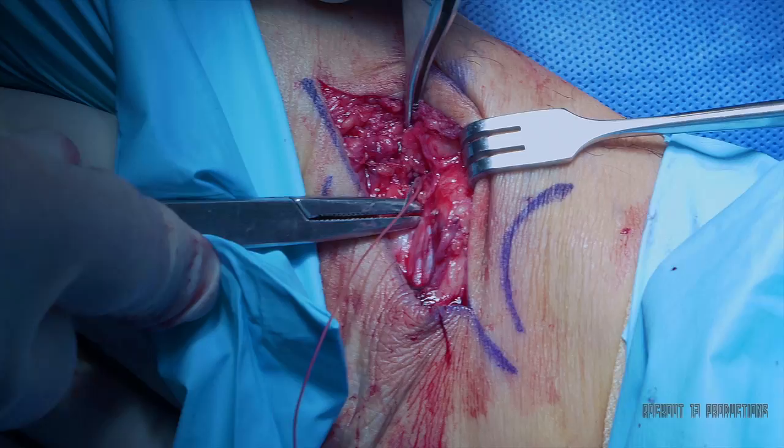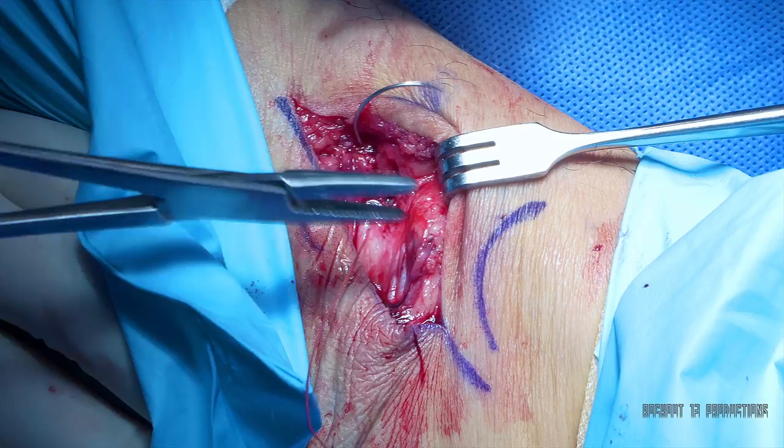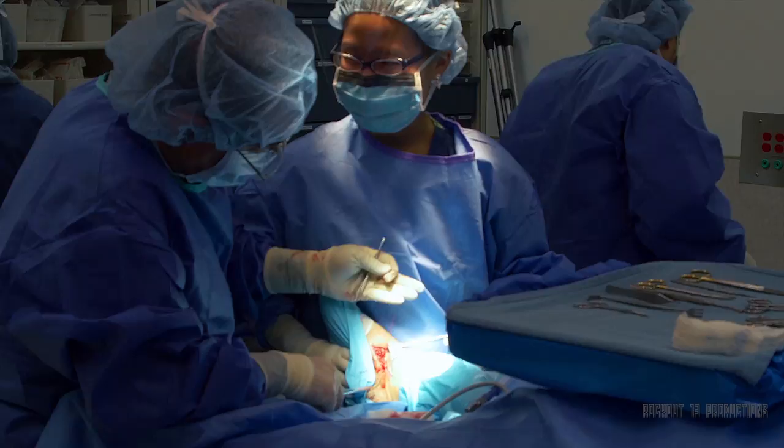Once the tendon repair has been completed, the deep structures including periosteum and synovium are enclosed over the tendon as one layer. This reinforces the repair.